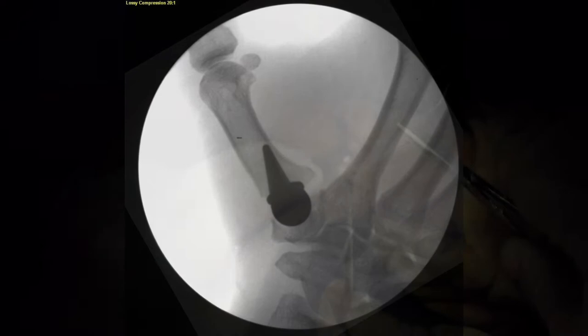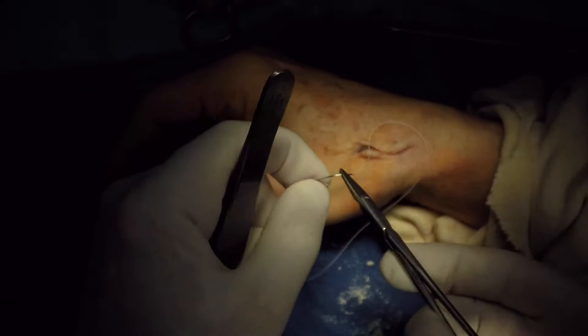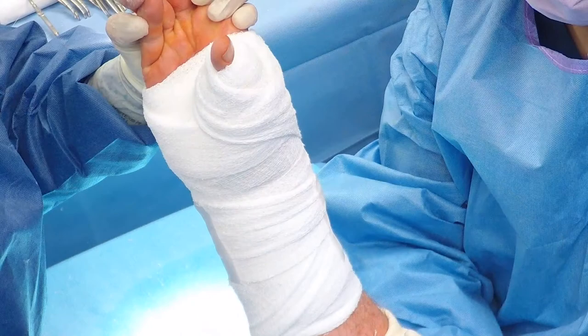The closure will be done using Vicryl so that the insertion of the APL and the capsule is secured. This will provide further stability. Closure to skin is simply done with 4-0 Vicryl interrupted stitches.